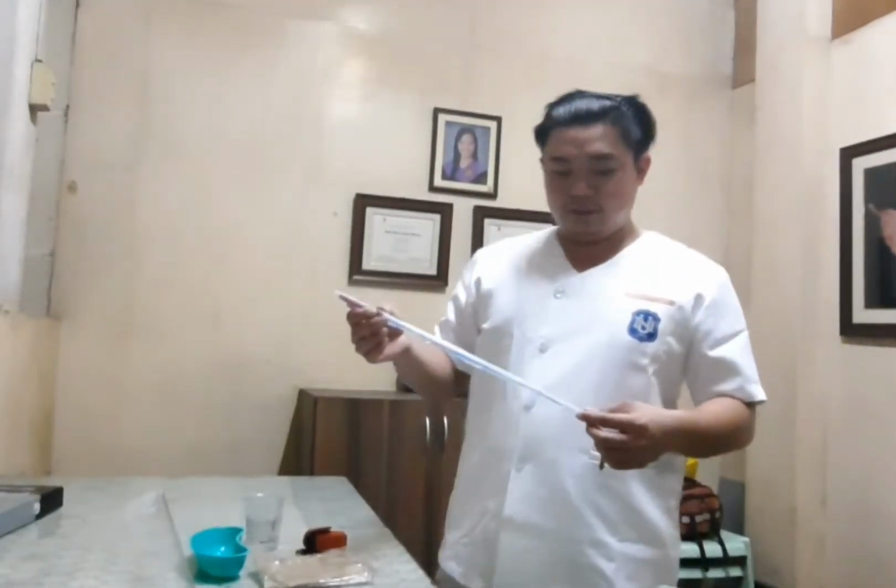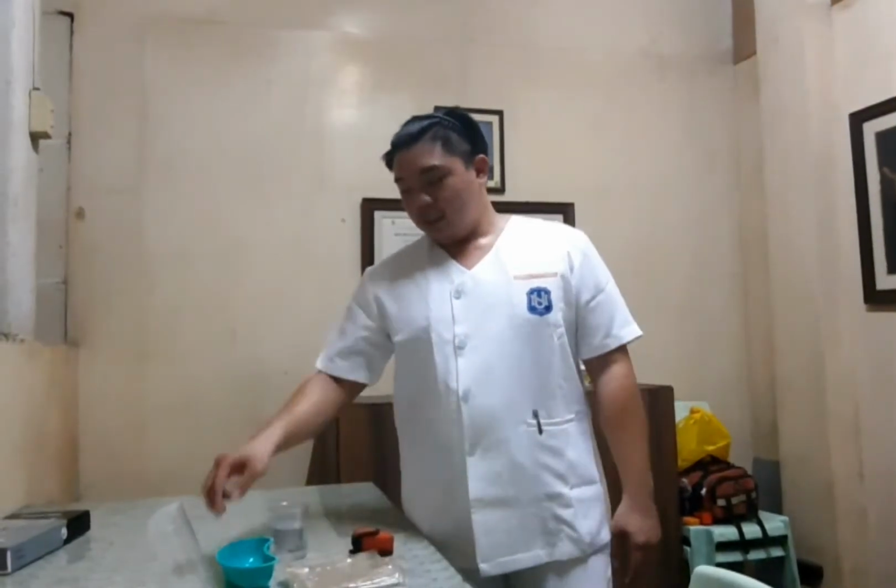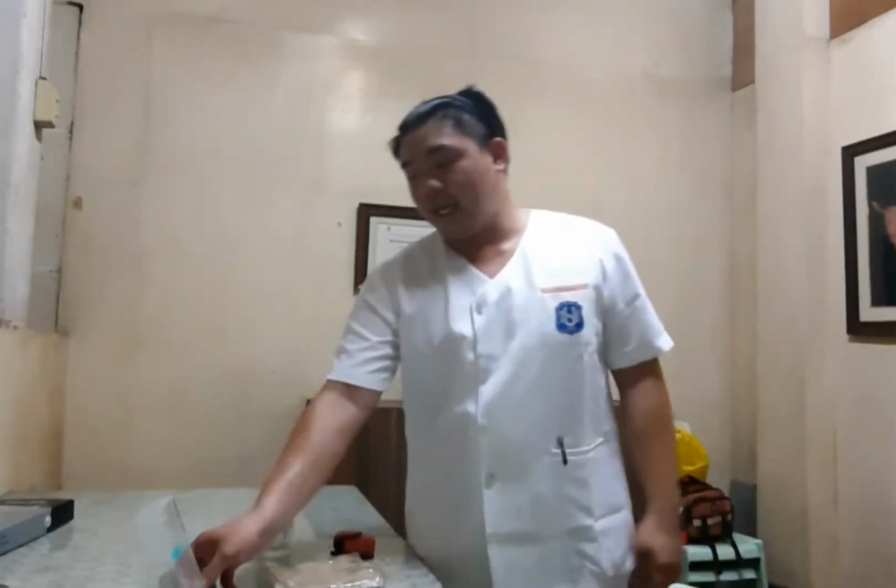And also the suction catheter, which is the main equipment needed in the suction. Also the pulse oximeter to monitor the vitals or the oxygen saturation of the patient. Kidney basin, the normal saline solution or the NSS. And I do not have here the water soluble, but water soluble is applied to the suction catheter before we put it into the nostrils.